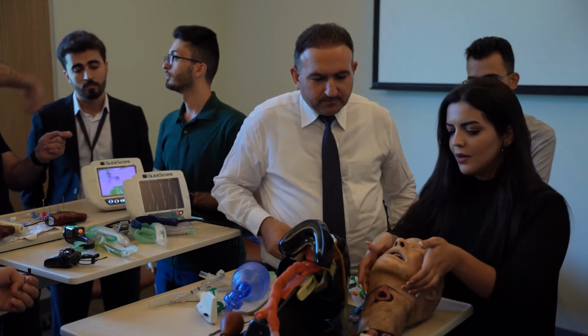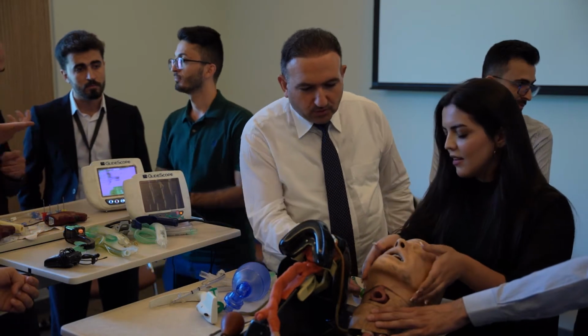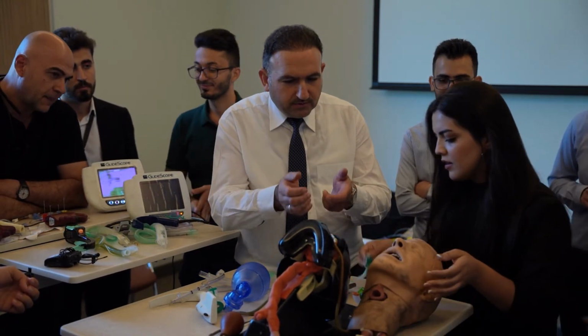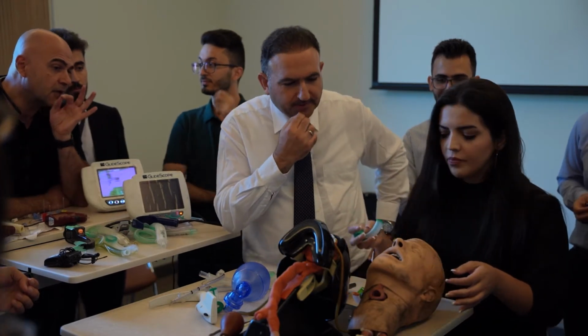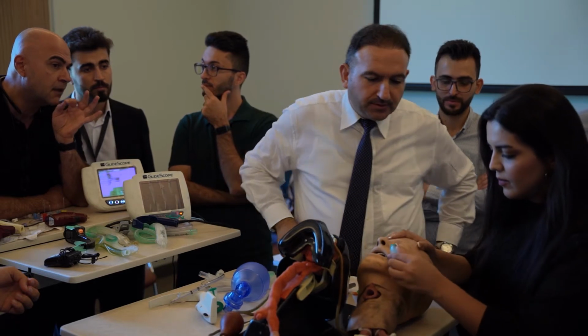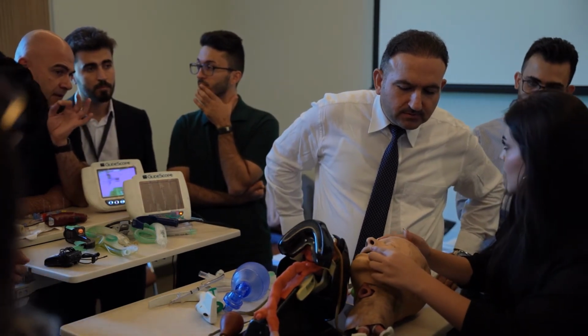There is no such thing as that. Our country used to do it like that, just twisting. This is not suction, this is torture. Move upwards. If there is no gag reflex, you can go deeper. In that case, clean all the pharyngeal cavity from any secretion, bleeding, or foreign body.